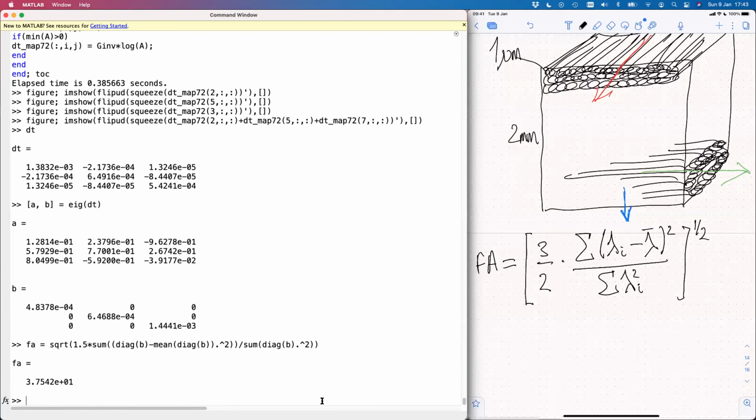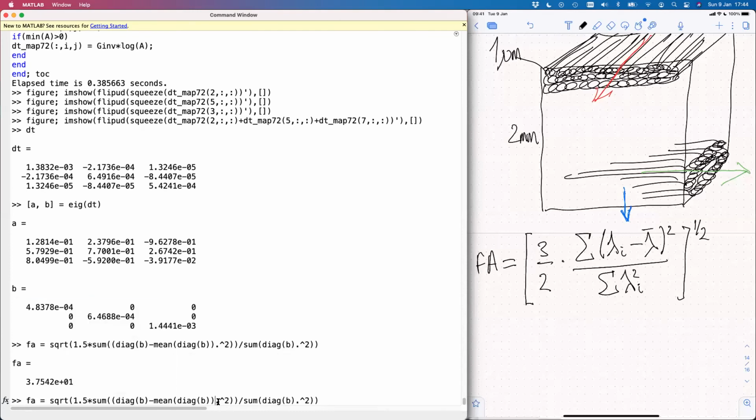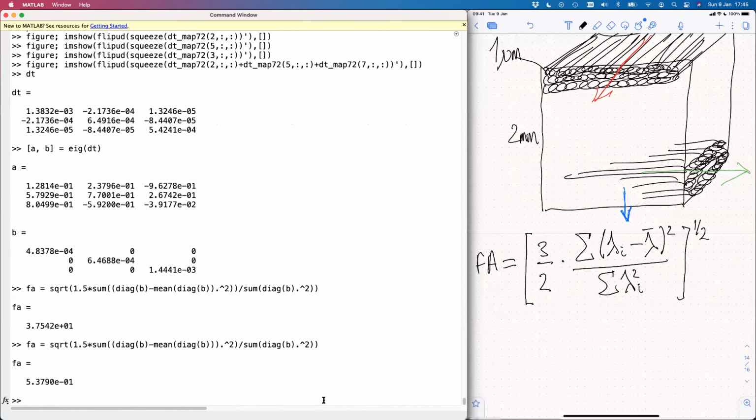Let's see, that can't be right. Something's gone wrong here, because it's greater than 1, so let's just read that. Got some brackets in the wrong place. It should have 1 here. That's better than squaring those. So got 1 too many there. I think that's correct now. Yeah, okay. So that's come out as 0.5 now, which is more sensible.